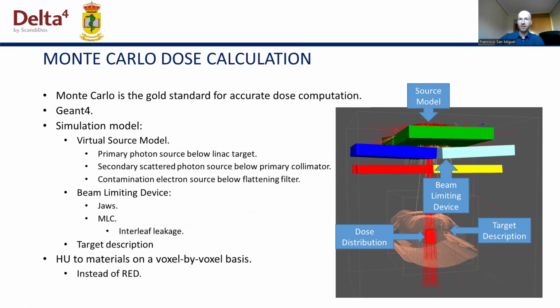The Insight Monte Carlo dose calculation was particularly relevant for us since we use the Monaco treatment planning system, which performs those calculations using a Monte Carlo algorithm based on a different computation. In addition, for these calculations, Monaco uses electron density rather than mass density as the primary input parameter for material assignment and dose computation.